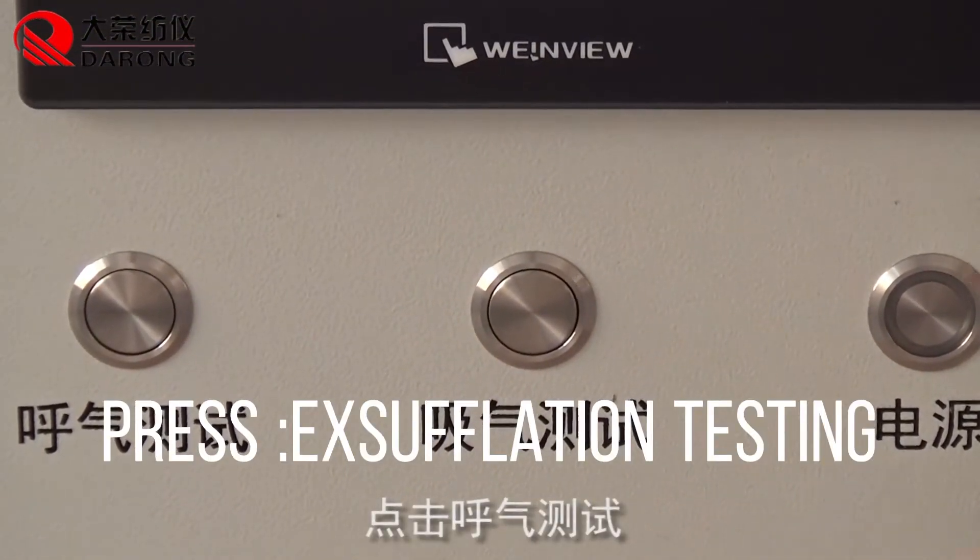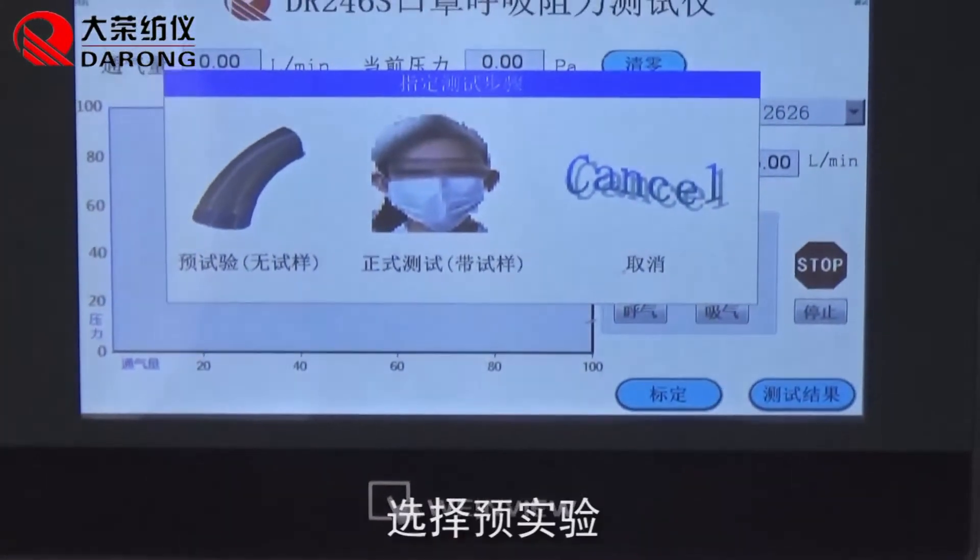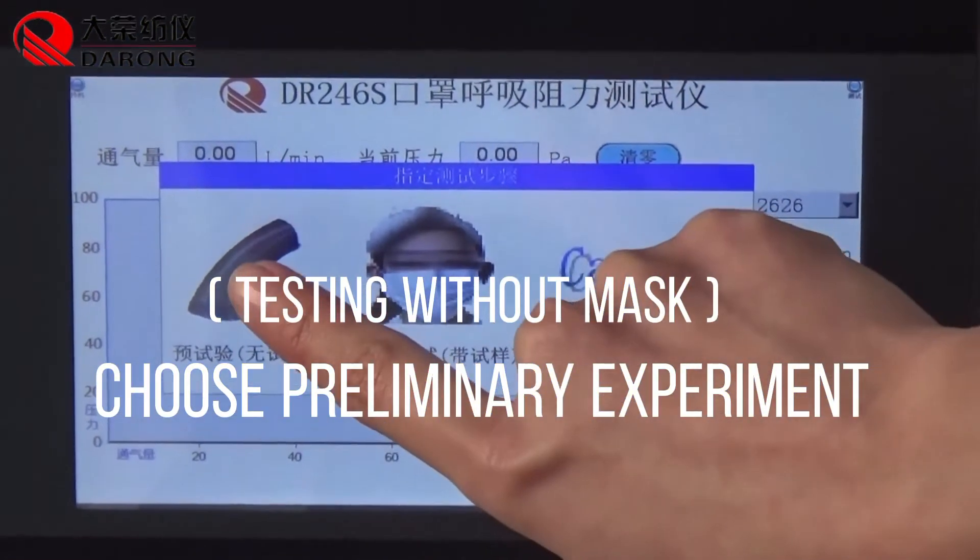Press exsufflation testing, then choose preliminary experiment.